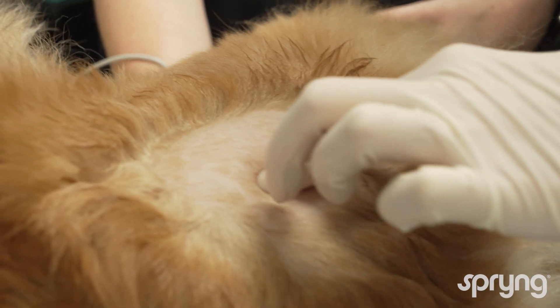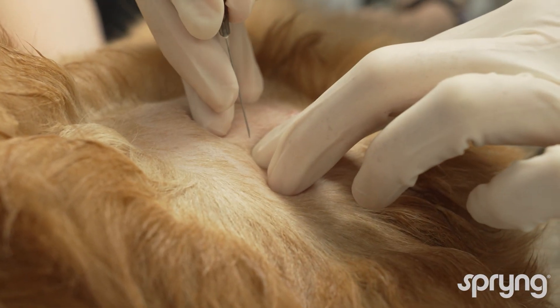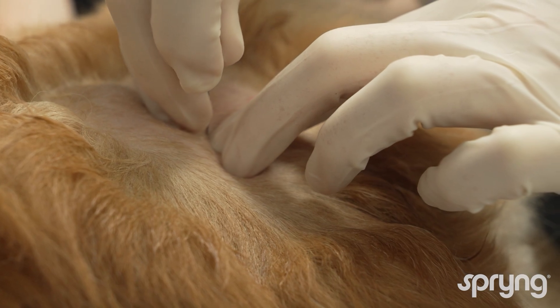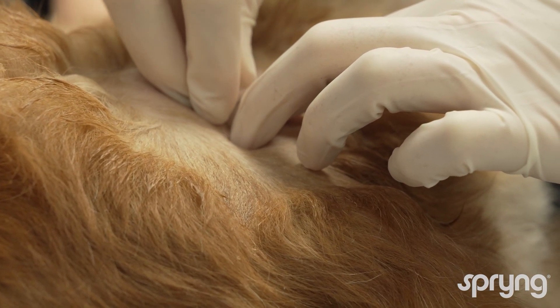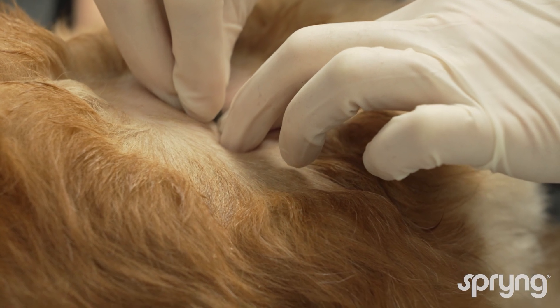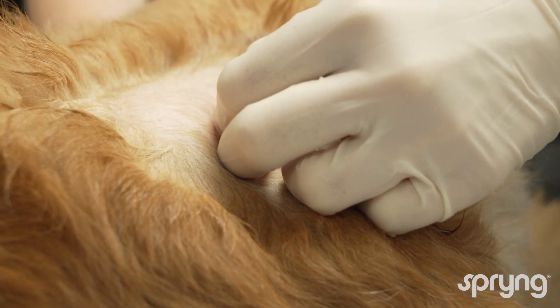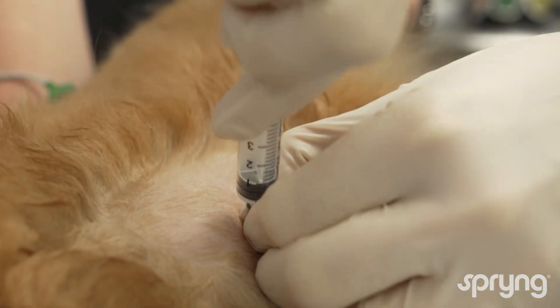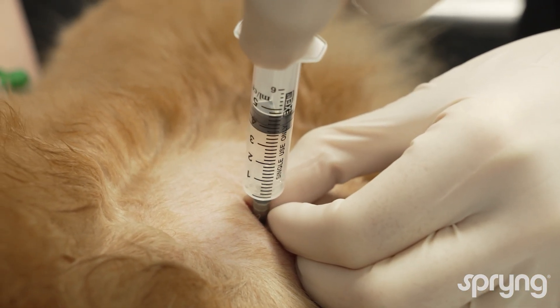Have the assistant hold the limb at a neutral standing angle. Insert the needle at the proximal end of the greater trochanter and walk the needle down the head of the femur. It may meet the acetabulum, and the assistant can apply gentle traction on the limb to allow the needle to fall into the joint.